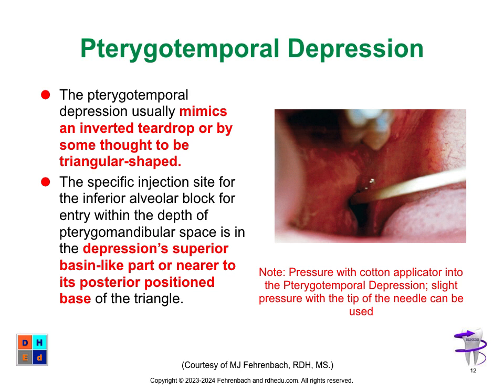Now, the reason why I say that is because some people think it's triangular shaped. But in many cases, you'll see it as just a rounder thing, sometimes oblong. It depends, again, on the patient. Here we're using a topical, slight pressure. You can also use the tip of the needle right before you enter. So again, topical, you can check it out. Make sure you keep your topical there for 3 minutes. I know they say 1 minute on the outside of the thing, but if you look closely at the MSDS, it says 3 minutes. I like that 3 minutes. It's relaxing the patient. It's relaxing me.